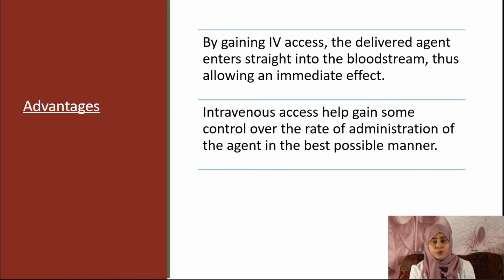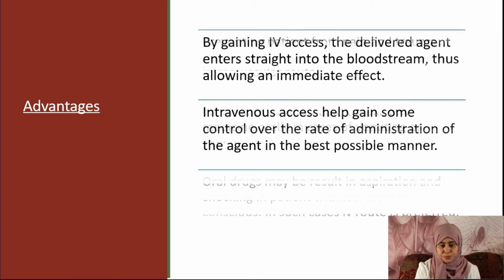The advantage of using IV access is that the medication or agent enters straight into the bloodstream, so it will allow immediate effect. Intravenous access also helps gain some control over the rate of administration or intake of the agent in the best possible manner, rather than oral routes.